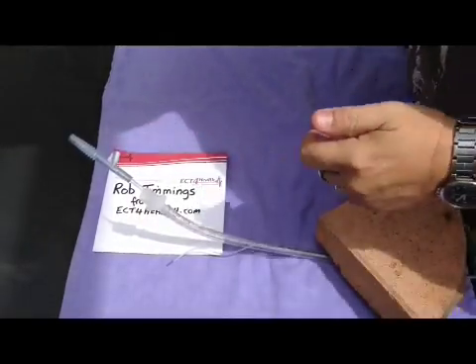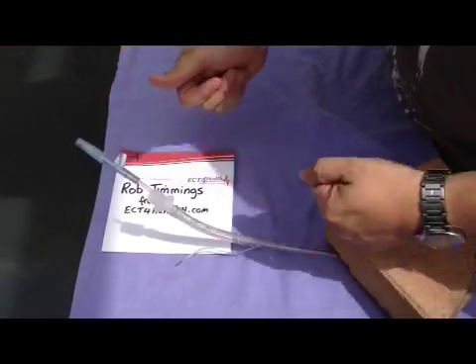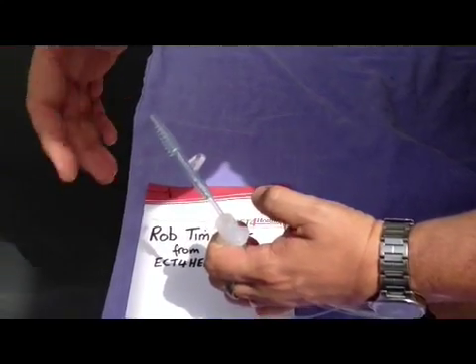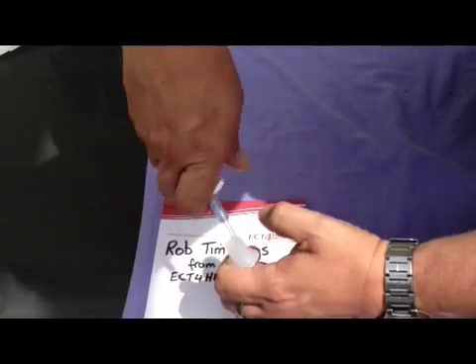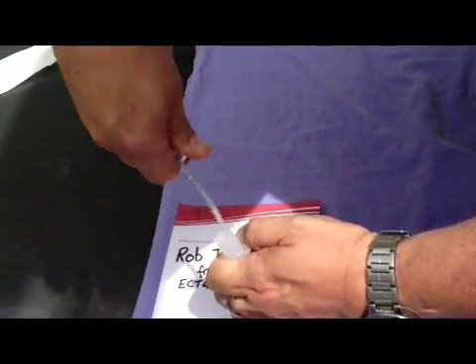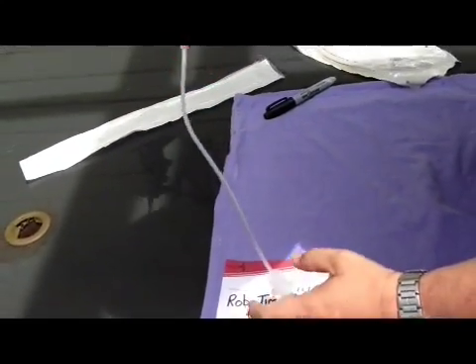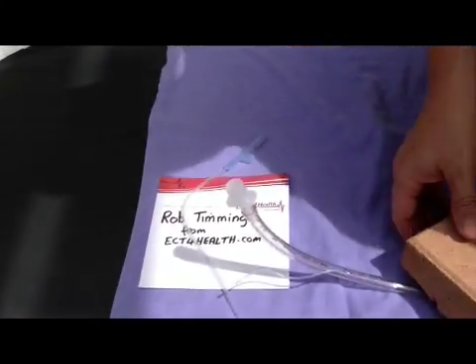Hi, it's Rob Timmings here from ECT for Health. Just a couple of tips on suctioning an ET tube. If you were trained to suction an ET tube any time in the last 5 to 10 years or even further back, you were probably taught to suction the tube by twisting the ET sucker — the Y suction catheter — as it was being removed. Not a very efficient way of suctioning the ET tube, and I wanted to show you why.